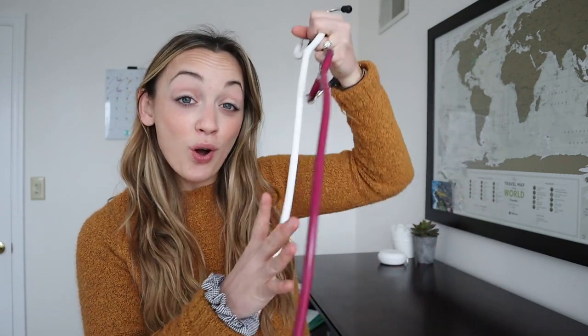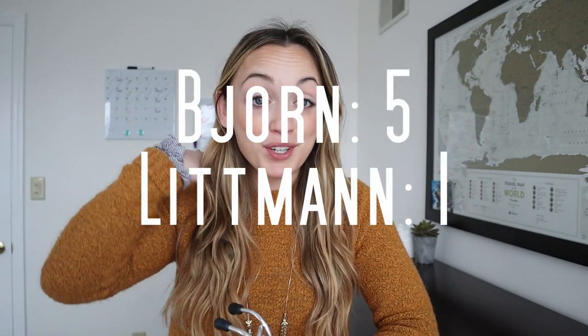Speaking about wearing a stethoscope around your neck, this leads me to the weight of the two stethoscopes. Even though the Bjorn Hall stethoscope is two inches longer than the Littmann, it is also lighter and doesn't pull on your neck as much. The Bjorn Hall stethoscope is only 5.1 ounces and the Littmann Classic 3 is 5.5 ounces.